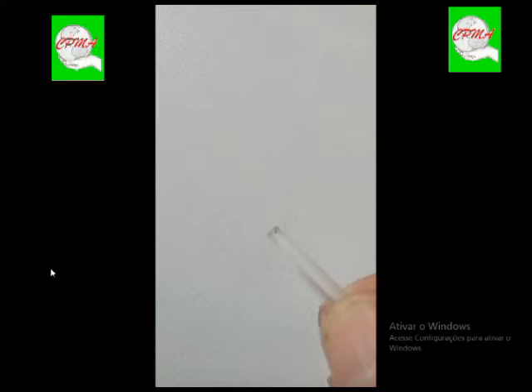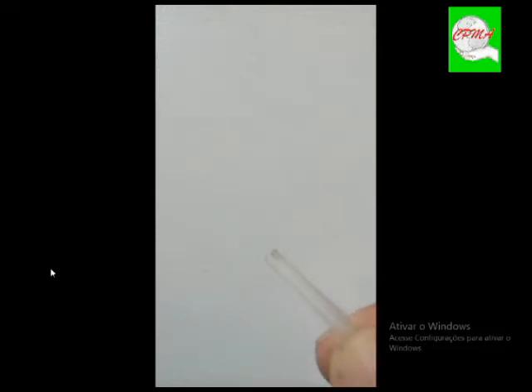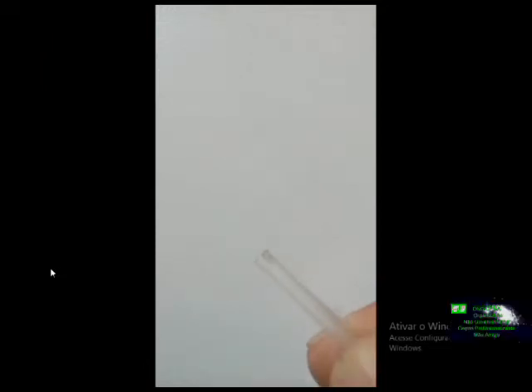Se você consegue enxergar, tá vendo? Aquele brilho ali — trincado. Esse é um trincado, muito trincado. Esse daí já era. Parece uma gota d'água na hora que você põe ela na rodilha. Trincou. Tem que substituir. Tem cinco nesse estado.